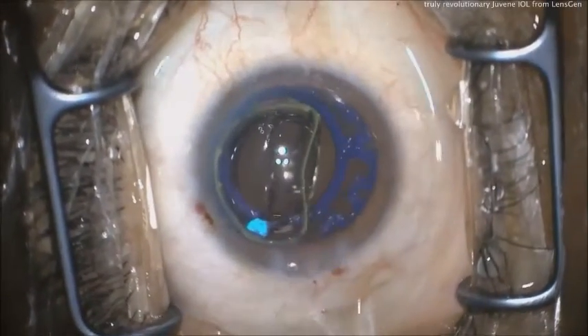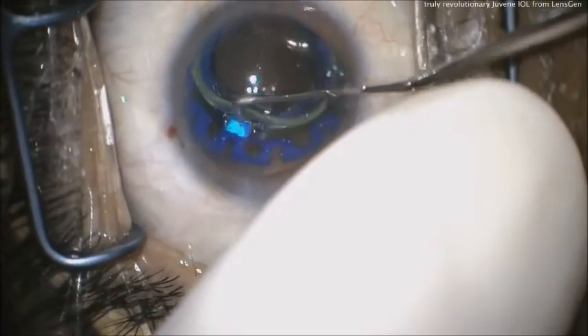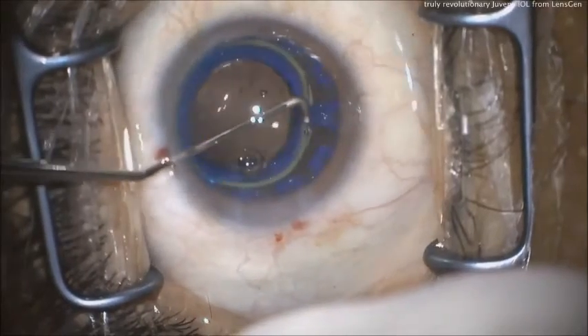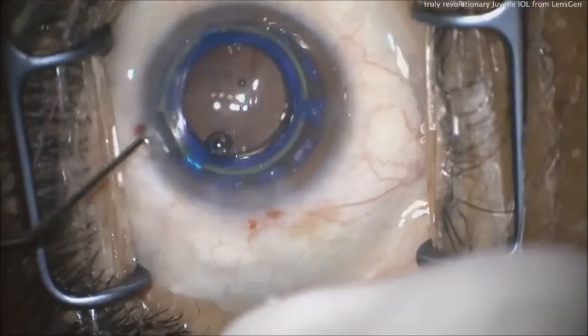There's the front lens — it's fluid-filled, that's the power lens. You'd think lens calculations are tougher, but they're actually easier, even though there are two lenses, because the effective lens position is so predictable. There's no capsule bag shrinkage or shrink-wrap effect, and shifting of the ELP doesn't happen here. Under all three tabs — that's all it takes.